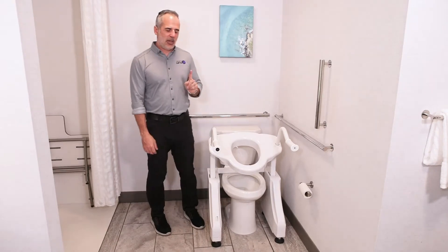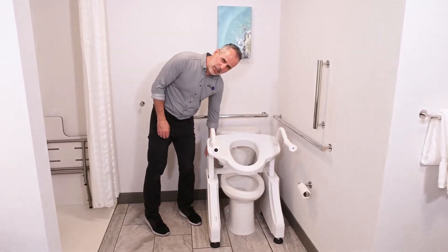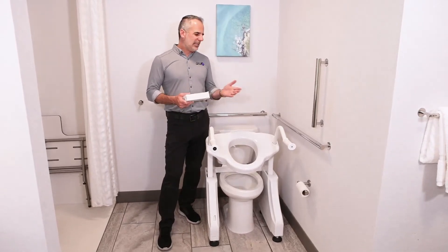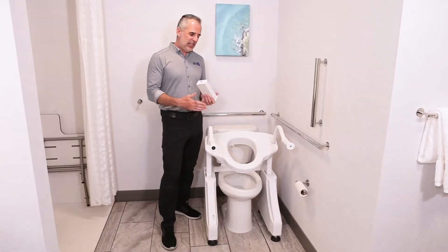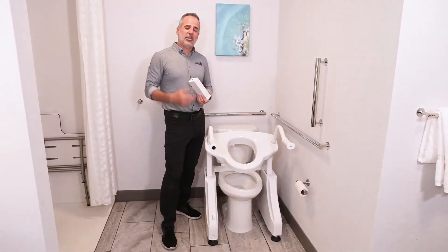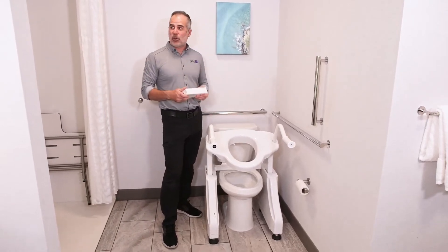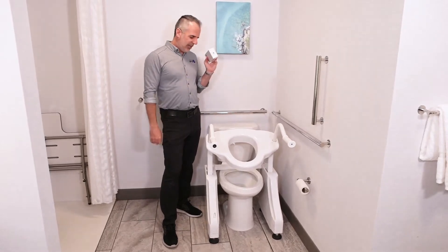Another thing that the DL1 has that a lot of toilet lifts do not is it operates on a rechargeable battery. Now you might be wondering why that's important — it's important because most bathrooms don't have an electric outlet near the toilet. In this bathroom it's clear on the other side of the room, so you can't run an extension cord across your bathroom floor near your shower. But a rechargeable battery is the ticket.